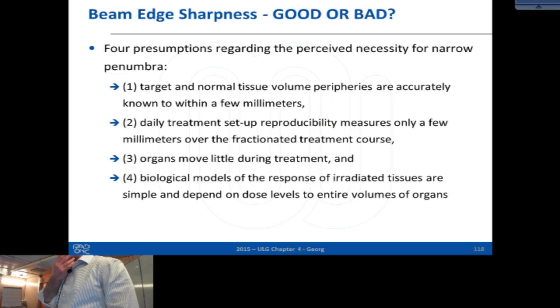Is there any big sense in making the penumbra even sharper than today? Is it correct to say that from the view of the clinic? If I understood correctly, it's still our ambition to do so. I mean, also with this dose painting that I mentioned, with adaptive radiotherapy approaches, but also when you look at particle beam therapy, or brachytherapy, where you have few spots where you put your radioactive sources, you can get very steep dose gradients.